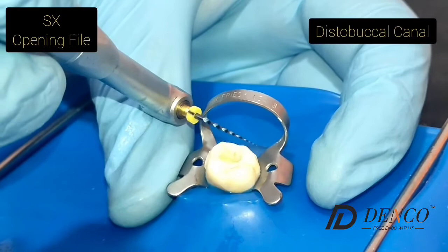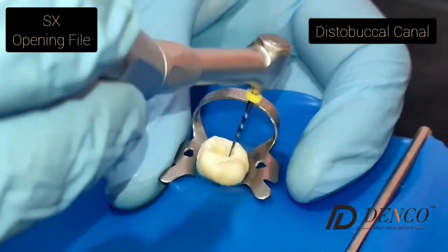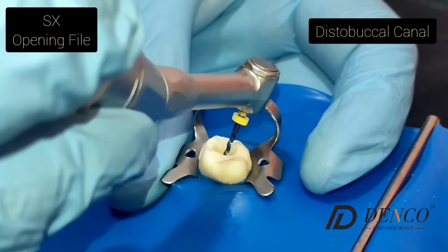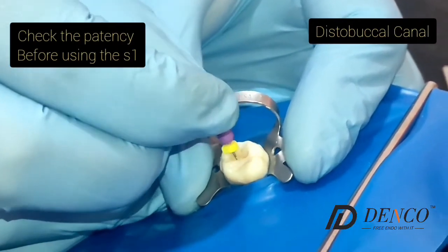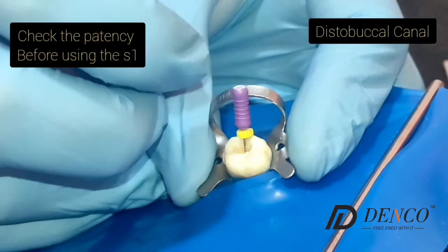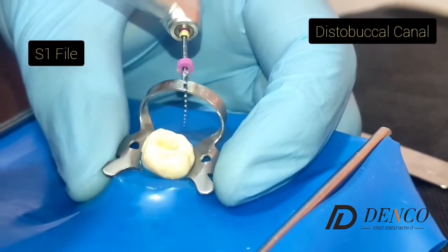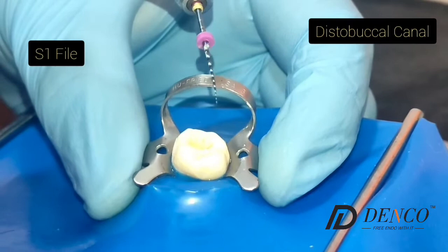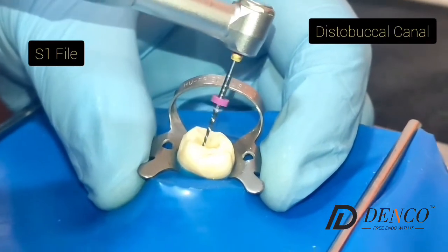We proceed to prepare the canal with the opening file, which will prepare only the coronal part of the canal, as we go to the distobuccal canal. There may be some resistance — that's normal. Remember the tip of the file is not active; it will act only in the upper parts. First we use our number 10 file to check the patency of the canal before using the S1 file. We proceed to use our S1 file — shaping one — which is going to prepare the coronal part and the middle third of the canal, used up until our available length.